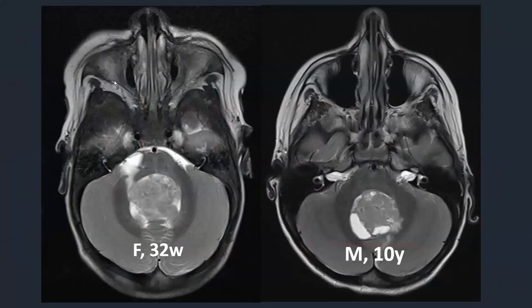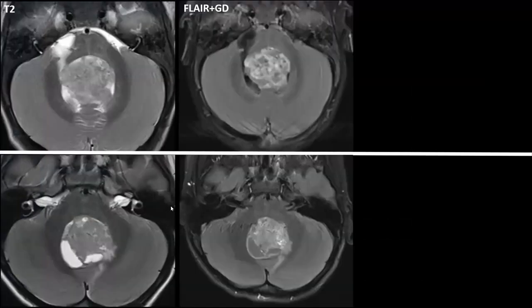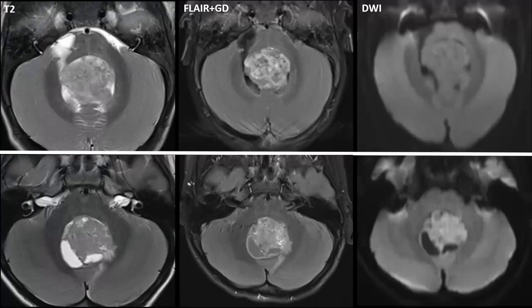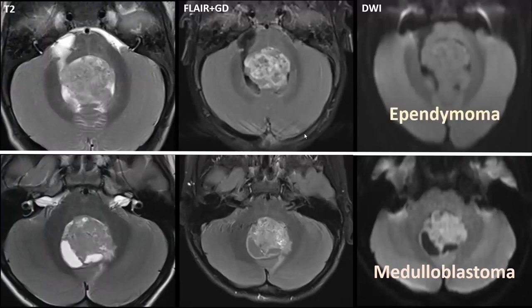Here is another lookalike — a 32-week-old vs. a 10-year-old boy with a medulloblastoma. On T2 and gadolinium images they look similar, but on diffusion: the medulloblastoma has diffusion restriction while this other tumor has no diffusion restriction whatsoever. This was an ependymoma. The key difference between medulloblastomas and ependymomas is diffusion restriction — ependymomas generally don't have it unless they are high grade. Another differentiator is the growth pattern.